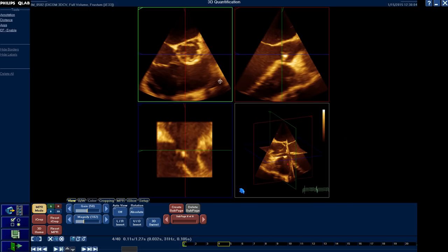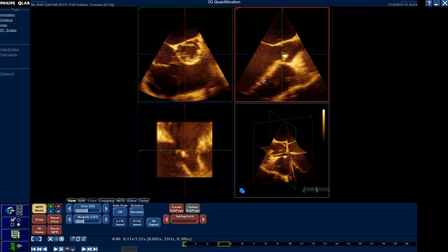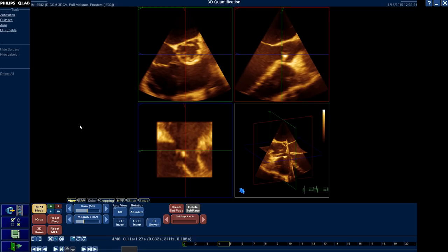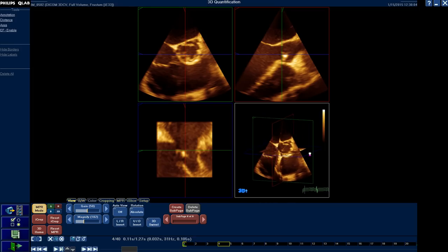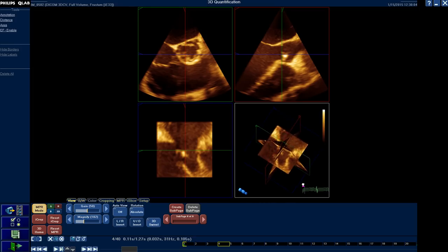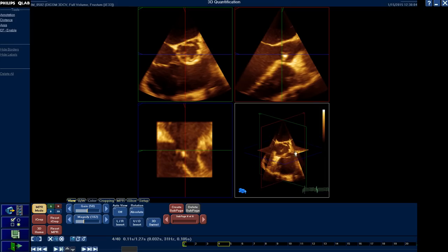As you all know, the screen will be subdivided into four small squares: the green box, the red box, the blue box, and the three-dimensional box, which will show you the planes at which you are cutting.